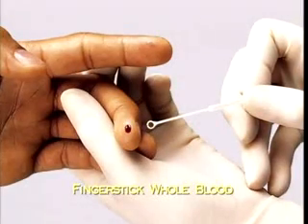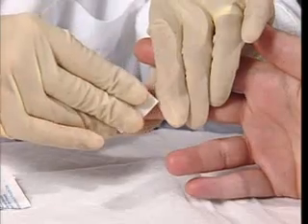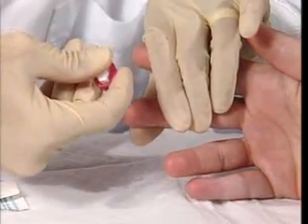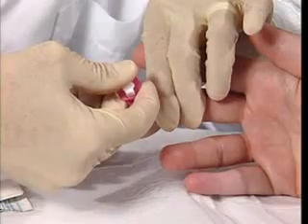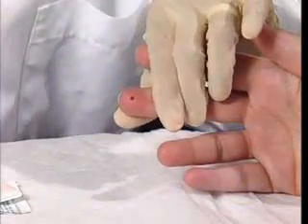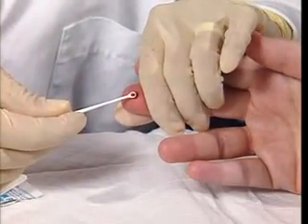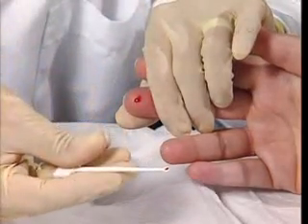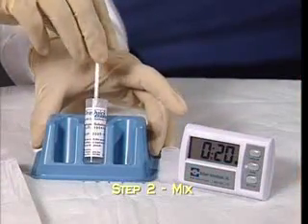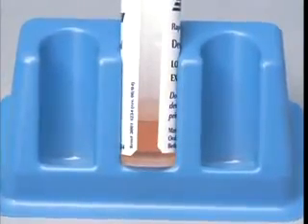The following demonstration will show proper use of AuraQuick Advance with a finger stick whole blood sample. Cleanse the patient's middle or fourth ring finger with an antiseptic alcohol wipe. Let it completely air dry, or wipe it dry with a clean gauze pad or cotton ball. In the area just off center of the finger pad, use a sterile lancet to puncture the finger. Discard the used lancet in the sharps container. Gently express a small amount of blood, wipe away the first drop, and express another droplet. Avoid excessive squeezing of the finger to make it bleed. Touch the round end of the specimen collection loop to the blood droplet and inspect the loop to be sure the blood specimen is completely contained within it. Immerse the blood-filled collection loop — without touching the sides of the vial — all the way into the developer solution vial and stir gently. The solution should look pink if the sample was added correctly.